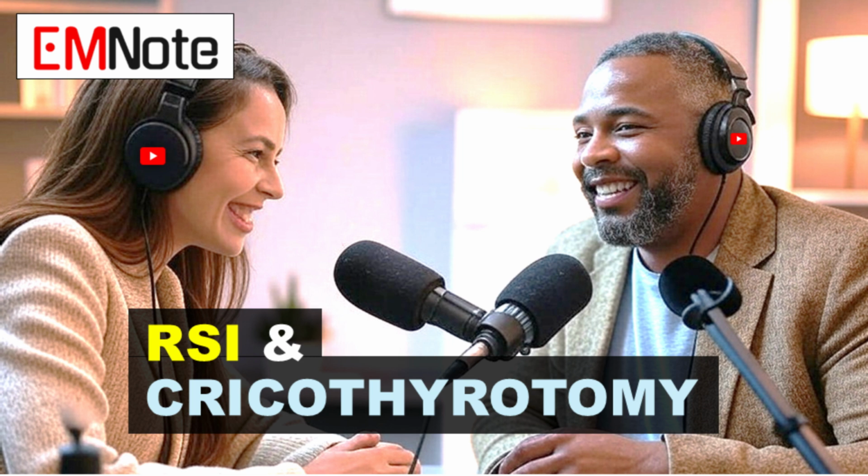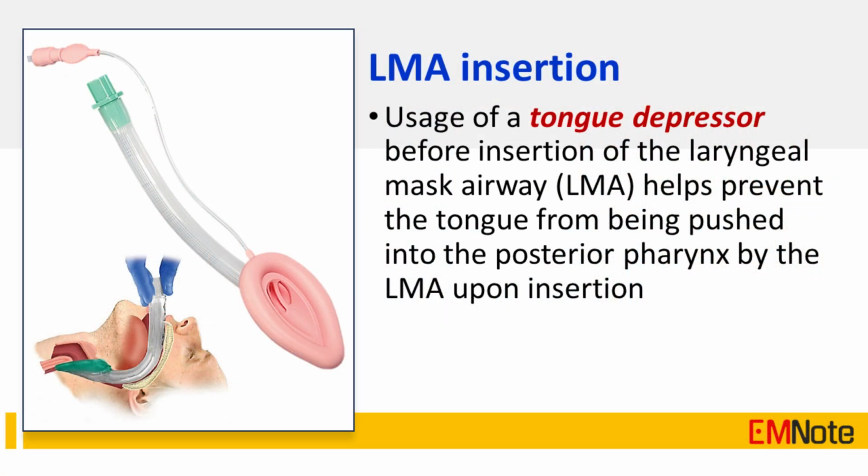Another area of innovation is the development of new airway adjuncts, such as supraglottic airways. Supraglottic airways. These devices are designed to provide a temporary airway without the need for endotracheal intubation. Got it. So they kind of serve as a bridge until a definitive airway can be established. Precisely. They're particularly useful in pre-hospital settings or in situations where intubation is not immediately feasible.